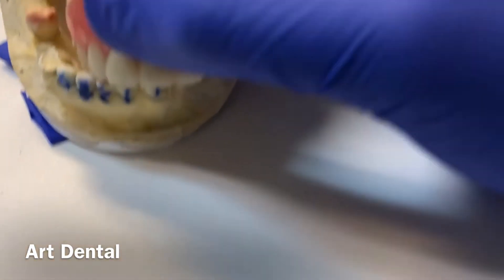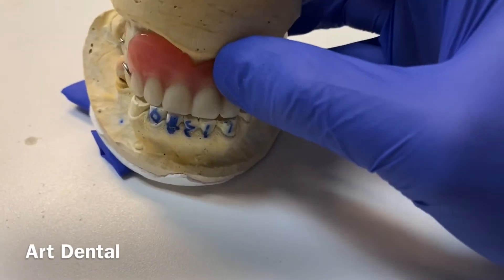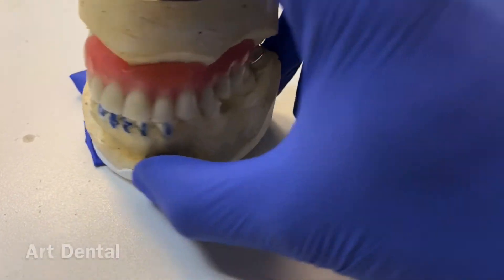We actually also made another temporary denture on the bottom for him, so he can have more teeth to eat with.